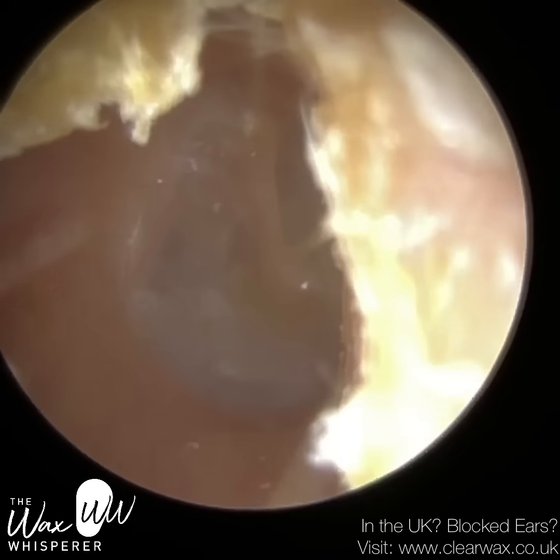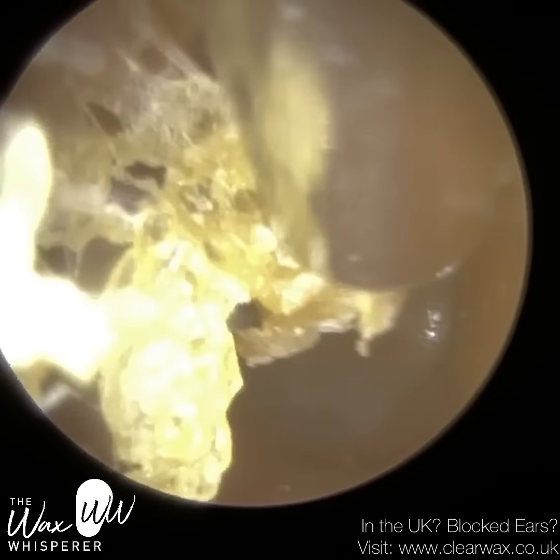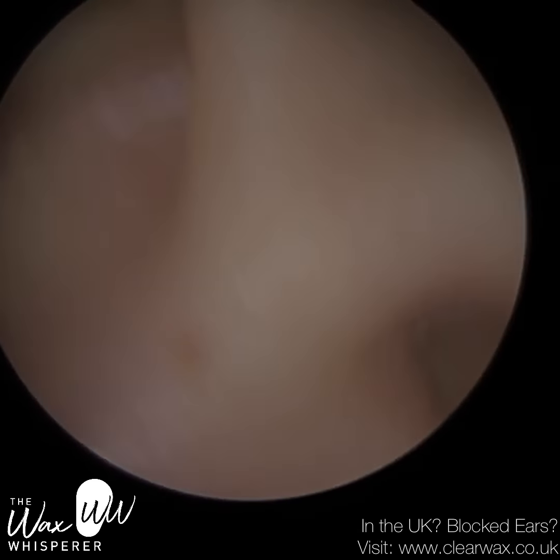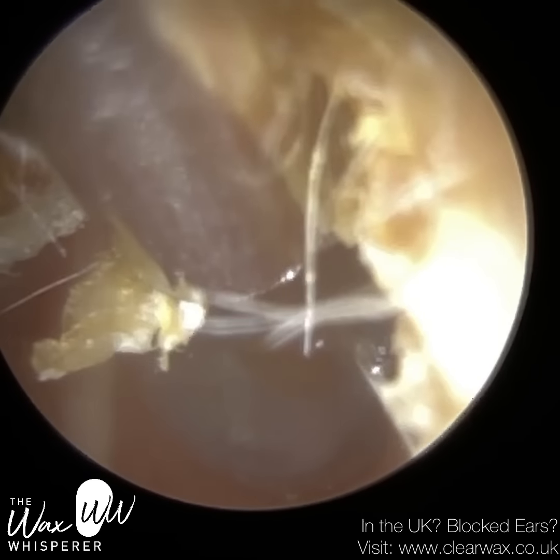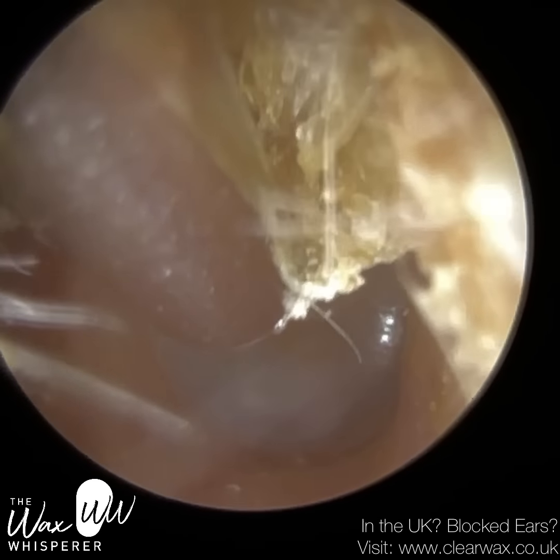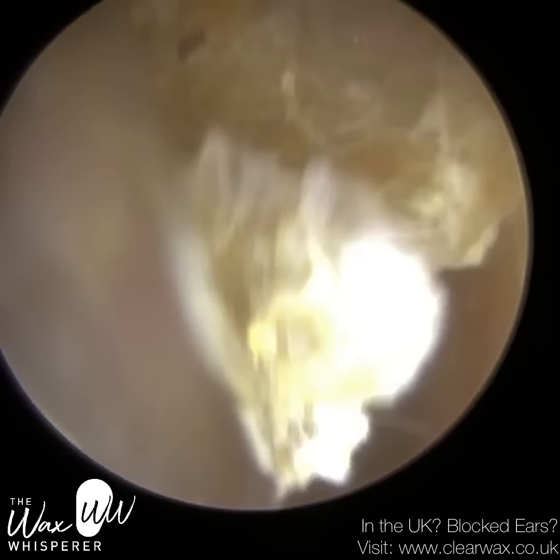The only other slight issue when performing a skin peel in a child is that the entrance of the ear canal typically is quite narrower than adults, and because you're working delicately on the bony part of the ear canal, you just need to make sure you've got enough working space within the ear canal because otherwise you can quite easily bump into the side of the ear canal walls and graze it, and we don't want that because that'll be uncomfortable for the patient.